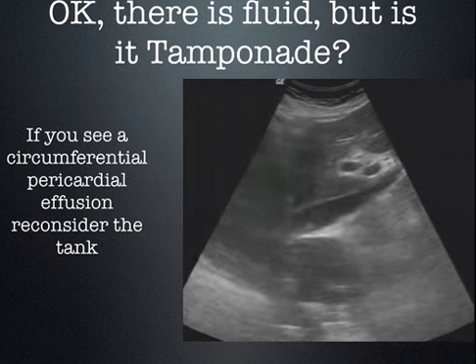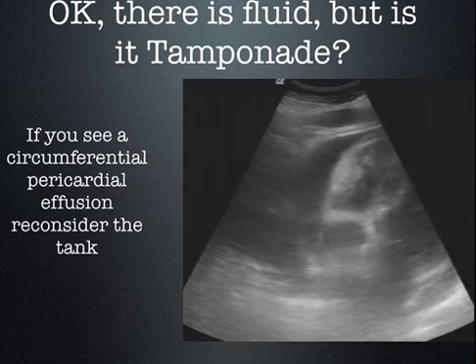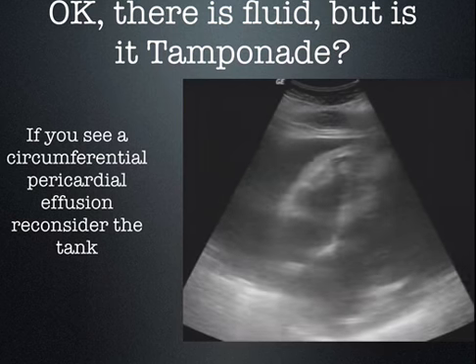Highly collapsing. In fact, I'll say it's 100% collapsing. This patient does not have tamponade. All right, it'd be the first tamponade that's ever been found that has low right heart filling pressures. This patient doesn't have tamponade.